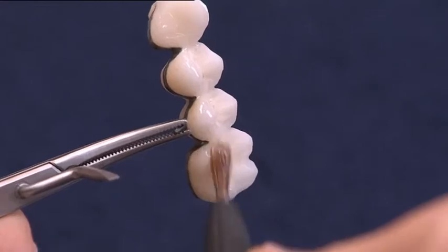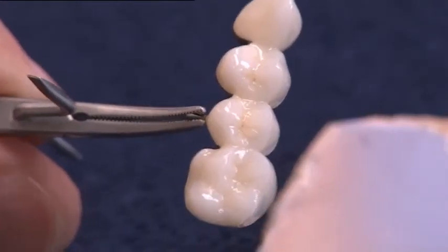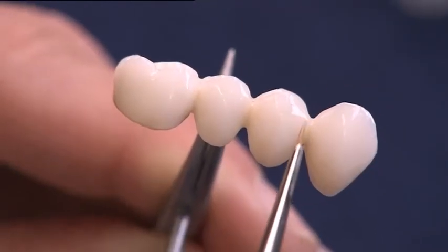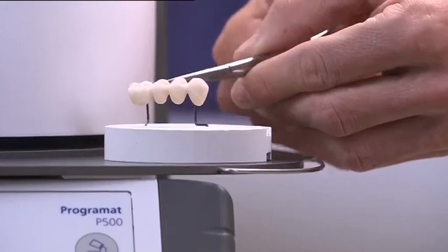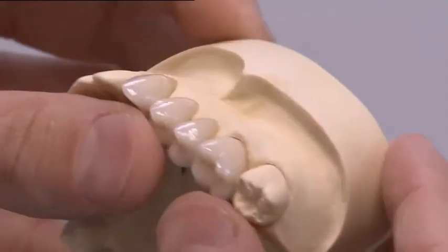Apply a thin layer of glaze paste on the ceramic bridge and add individual characterizations such as discoloration and enamel stains in the interdental and occlusal areas. Final check of the shade, fit, and function of the restoration.